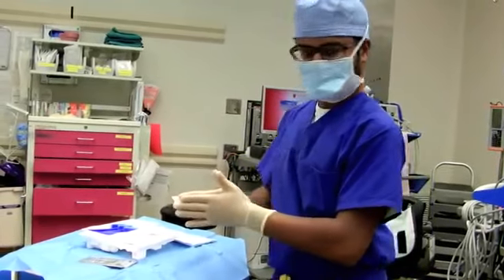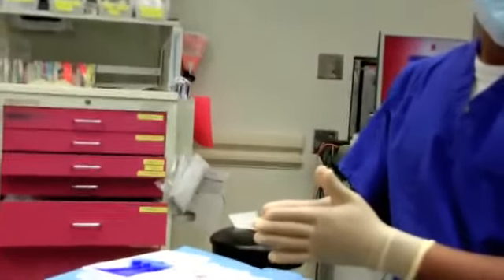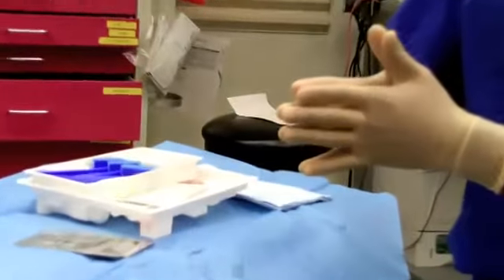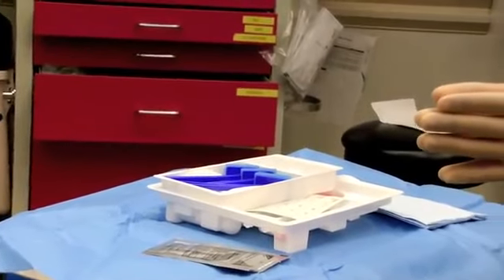Using the smallest provided needle, make a wheel of local anesthesia at the previously marked site. Ask assistant to add morphine to your bupivacaine syringe.